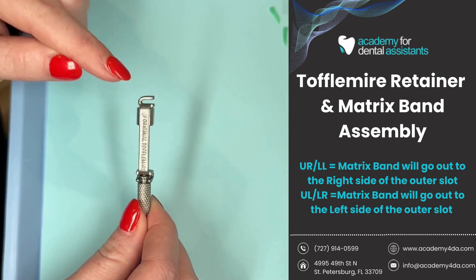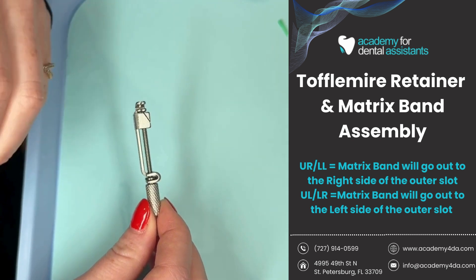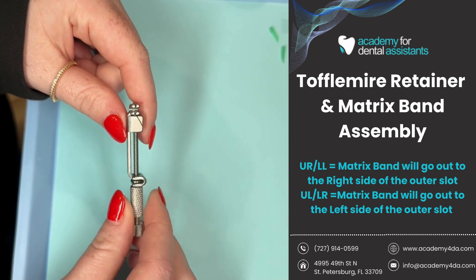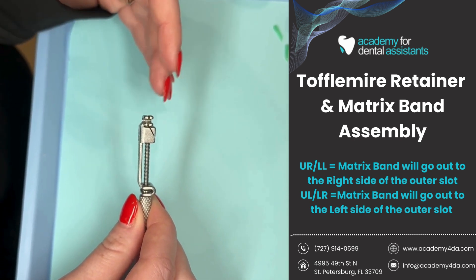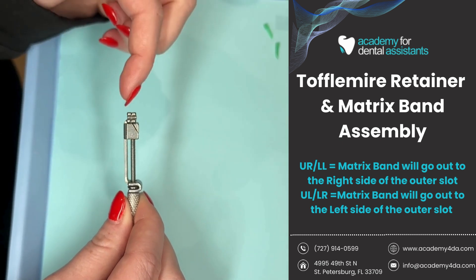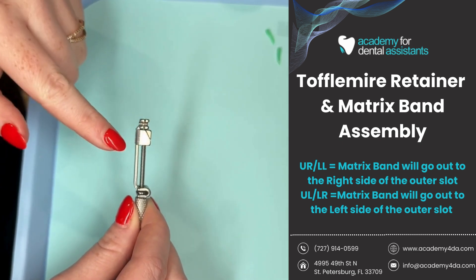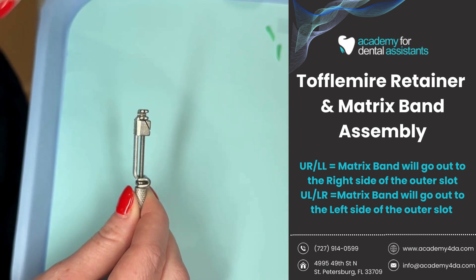You'll see that there are openings on the left side as well as the right side of this outer slot. That is because when we place our matrix band through the diagonal slot, we want it to come out of either the right or left side of this U-shape, and that's going to be dependent on which tooth we're working on. If it is an upper right or lower left, the matrix band goes through the diagonal slot and out to the right side of the outer slot. If we are working on the upper left or lower right, it goes out to the left side.